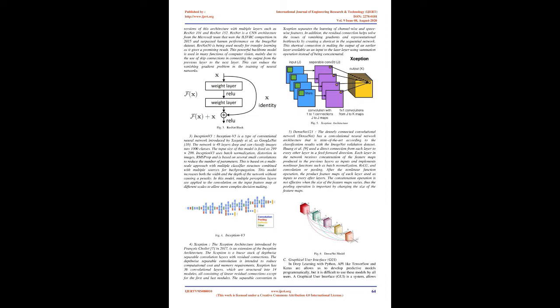First, we filtered out non-X-rays, CT images, from the collection. All good quality CXR images are resized to 224 x 224 pixels to train the model with a small number of parameters. Then, using data augmentation, we converted 350 CXR images of COVID patients into 700 CXR images with the help of a flipping algorithm. A total of 5,000 CXR images are obtained after the data increment. Then we split them into training, validation, and test data with a ratio of 8:1:1. Fig 1. Data preprocessing.